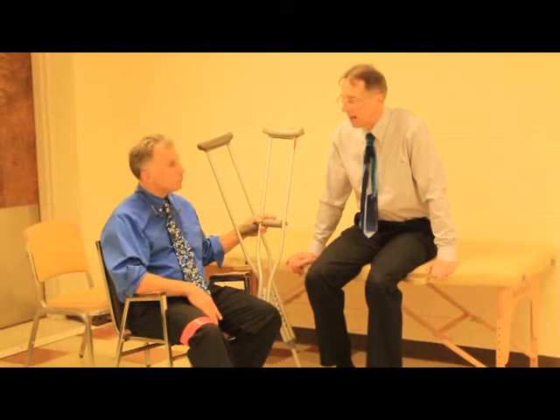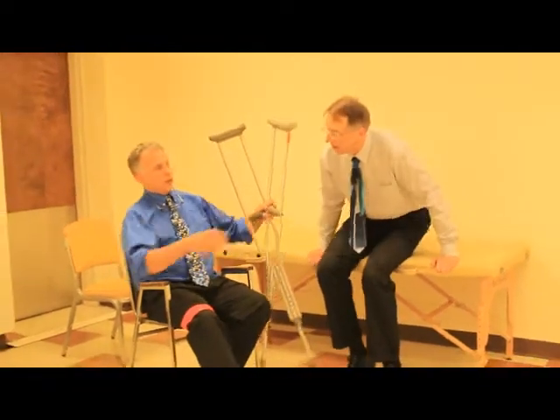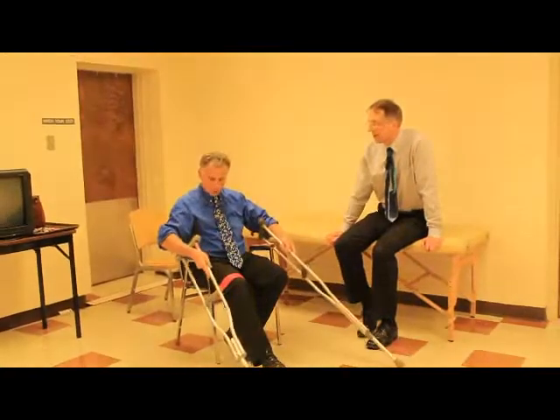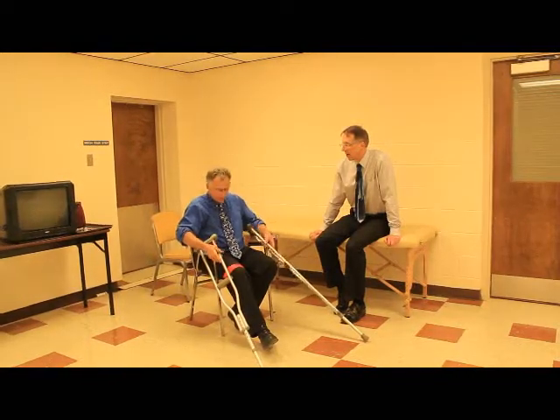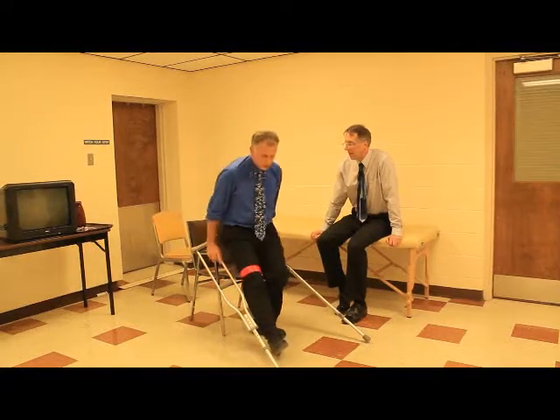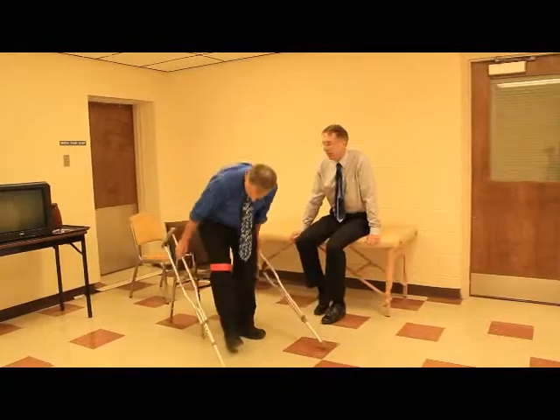this is how to get up and down from chairs. We're going to first start with a chair that has actual armrests. One way is you can take both crutches, put them out like that so that the armrest is exposed. Take the palm of your hand right there and right there, grab the crutches with your fingers and then just stand up. You move to the edge of the chair because it's very difficult to get out of a chair from the back of a chair.